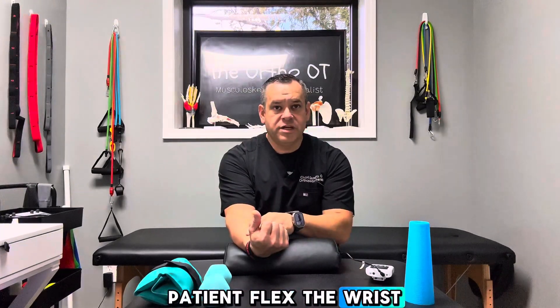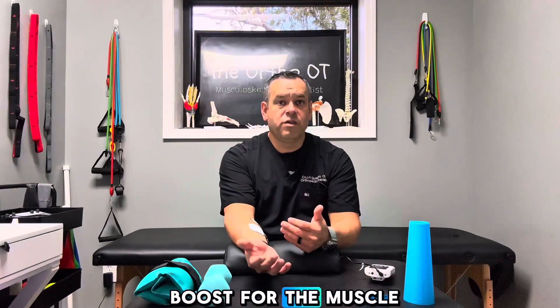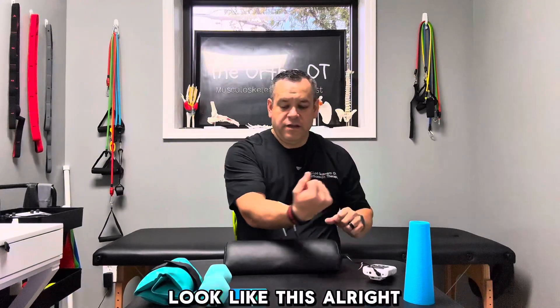Then you can start to have the patient actively engage. I have it here on my flexor mass, but you can put this anywhere on the body within safe guidelines — the quadriceps, shoulder muscles, bicep, whatever. It's going to contract. I'm going to have the patient flex the wrist and also curl the fingers down, actively using all those muscles we're trying to stimulate with the stem. We're giving that extra input or additional boost for the muscle contraction. Every time it kicks on and you feel it, make a fist and come into wrist flexion.